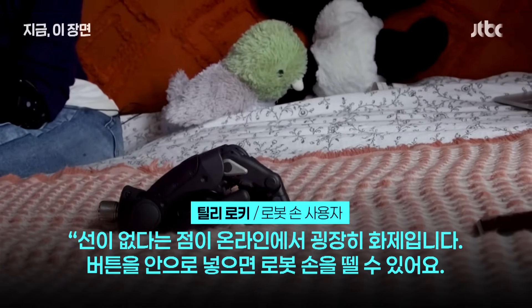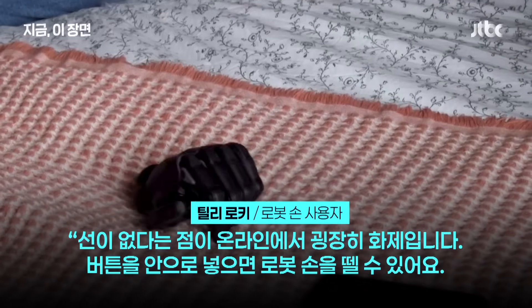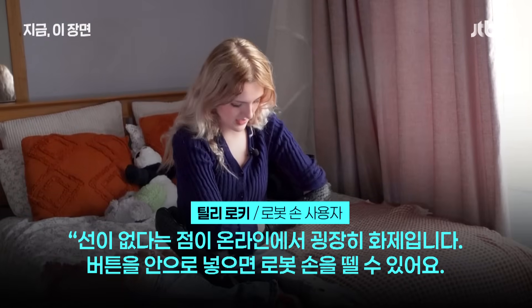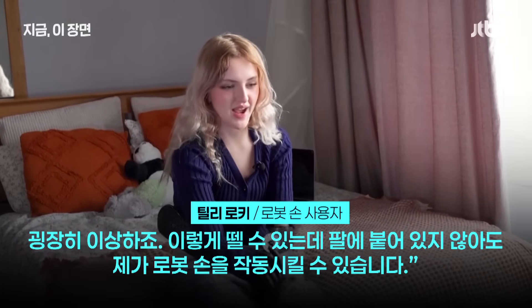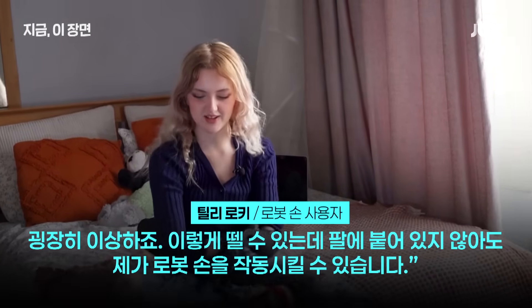One thing which has taken the internet by storm is the fact that they are completely wireless. If you push the button in, you can actually detach the hand — which is really weird. I can just pull it out like that, but I can still operate it when it's not attached.